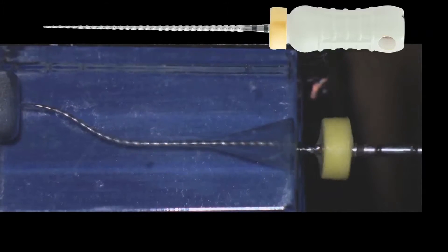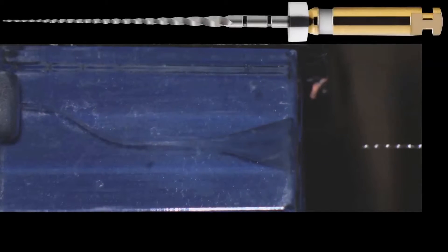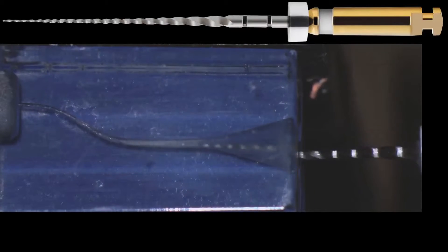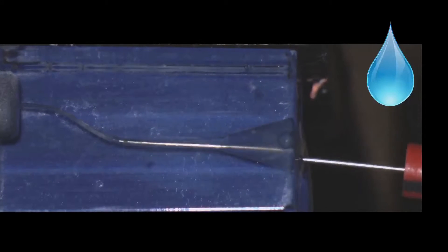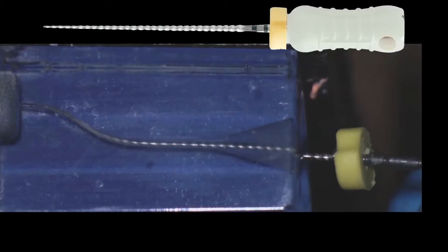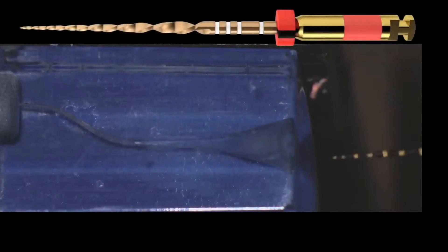We irrigate — remember, every file that comes out of the canal requires irrigation. Now we proceed to create the glide path. We use the ProGlider in increments of three millimeters, going all the way to working length. We irrigate again and ascertain that we have not blocked ourselves with the instrument used to establish working length. Then we remove the instrument, irrigate again, and proceed with canal shaping using WaveOne Gold in amplitude strokes of three millimeters.